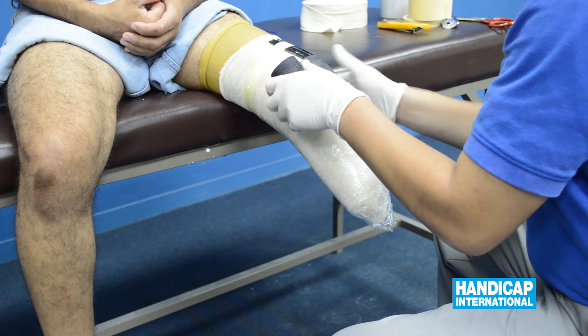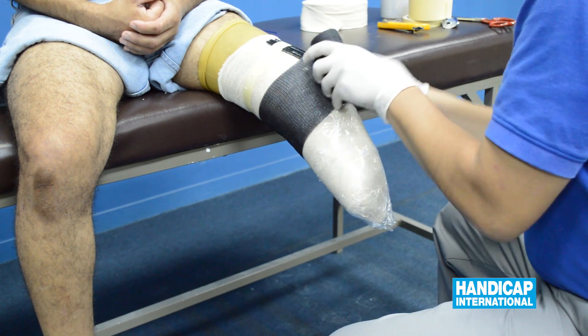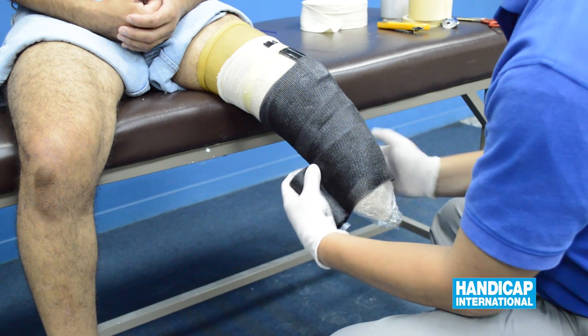Wet the bandage and proceed to place it in a circular movement on the stump, leaving the distal end free.